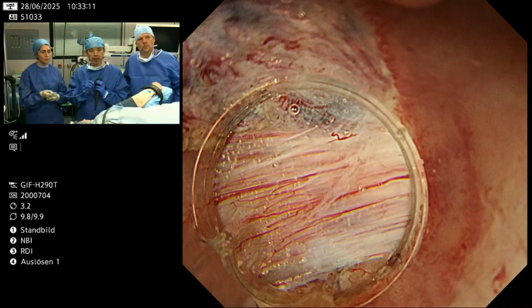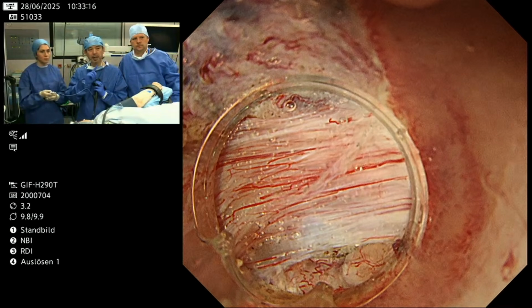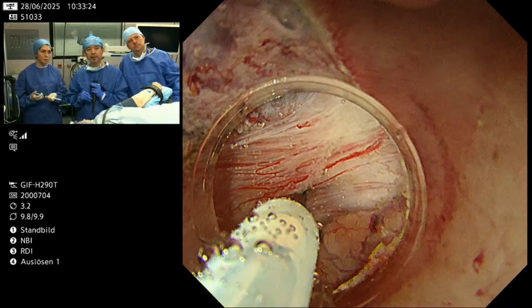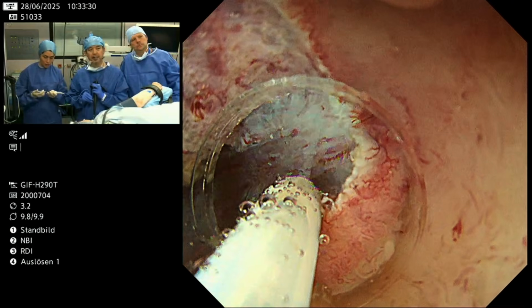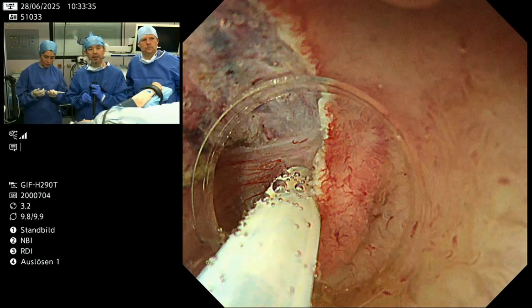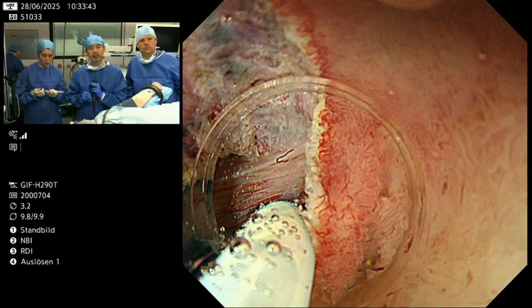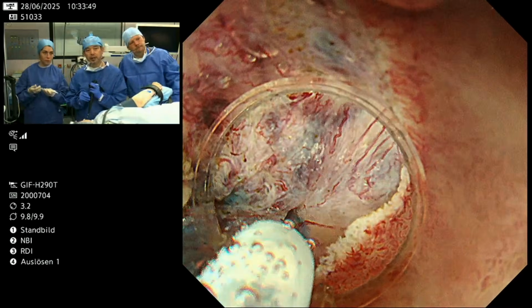But with the majority of this kind of big muscle traction, usually there is a thick blood vessel inside, so we should be very careful. Before starting the procedure, I would like to inject a little bit of hyaluronic acid with strong blue color to visualize the fibrosis. Okay, injection please. A little more. Okay, stop. Then I would like to inject also here, injection.